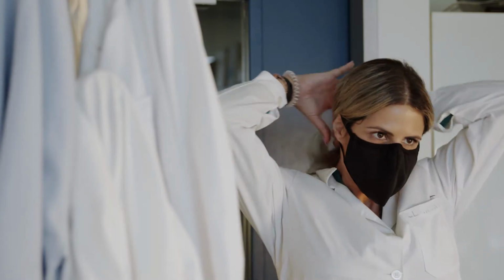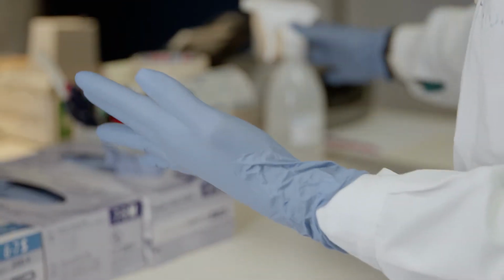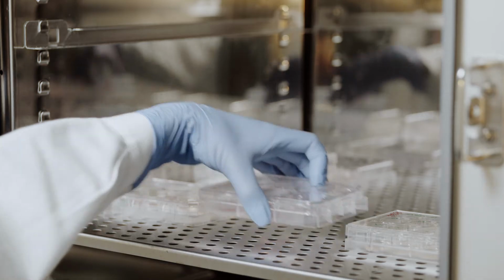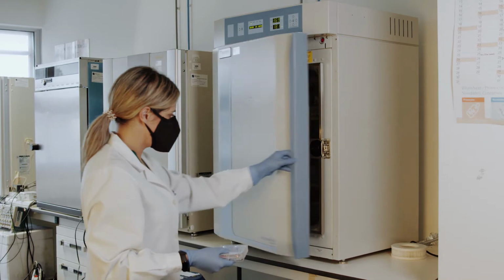Suspension culture is very advantageous at several levels. First, the logistics. It's easier to have just a few culture plates, 6 well plates for example, with a few wells with the cells as aggregates, than having a full incubator with dozens of T flasks with cells attached. Also, you are saving on the cost of the matrices, so you don't need any matrices for the cells to attach to. And a third one, using 3D cultures is really easy and it's more accessible if you really want to mimic the interactions that exist between cells in vivo.